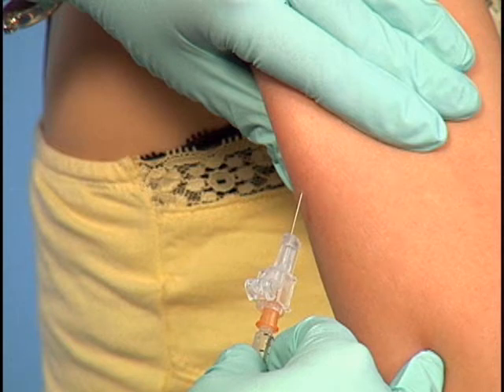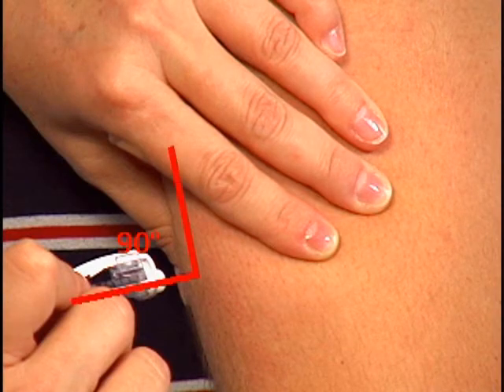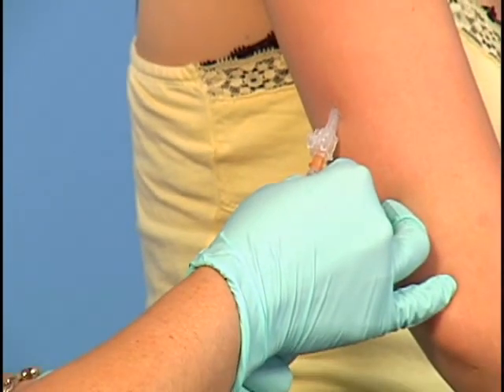Hold the barrel of the syringe between your thumb and index finger. If you are using a 5/8 inch needle, position the needle at a 45-degree angle to the arm. If you are using a 1/2 inch needle, position the needle at a 90-degree angle to the arm. Insert the needle quickly and smoothly to the hub. Remove your hand from the skin. Medication injected into compressed tissue causes pressure against nerve fibers, which makes it uncomfortable for the patient.